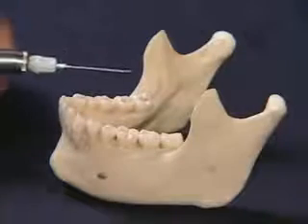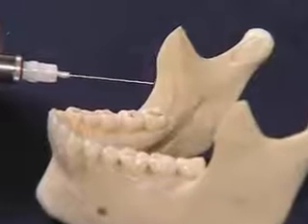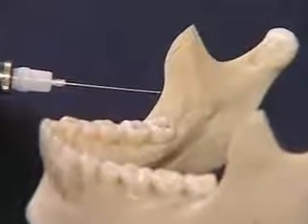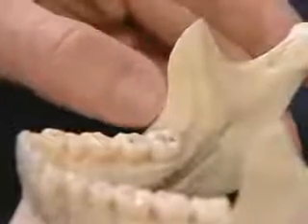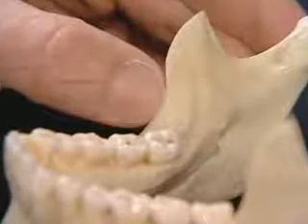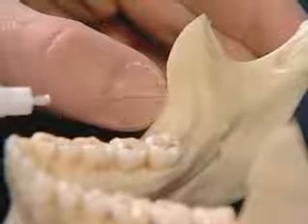You begin by looking at the anterior border of the ramus, which is shown here, and feeling the greatest depth, which is the coronoid notch of the external oblique ridge. This point should be palpated with your thumb or finger, and the greatest depth noted, because that will correspond to the height of injection, which is usually between the midpoint to height of your fingernail.